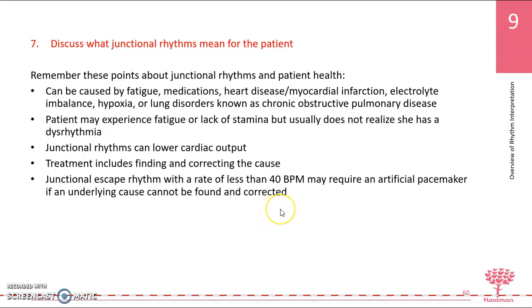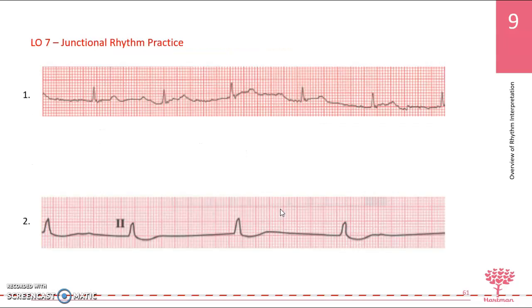It's really just your purpose to set them up correctly and do the EKG properly so you can get a good reading. If you see something that may be a little off or abnormal, you tell the doctor or the provider that, not the patient. You don't mention it to the patient. That's something important to remember about being an EKG technician.